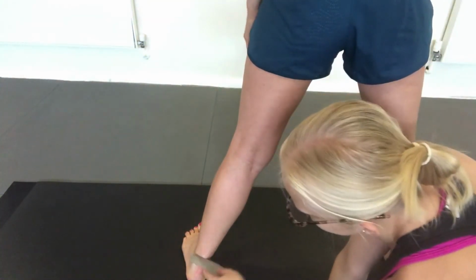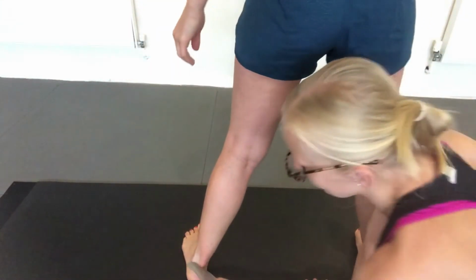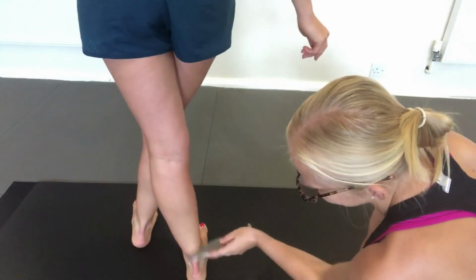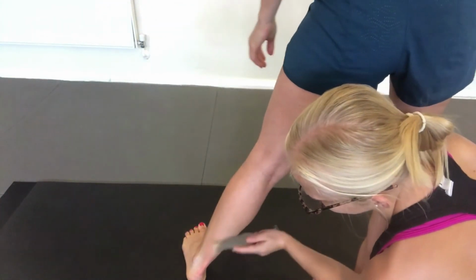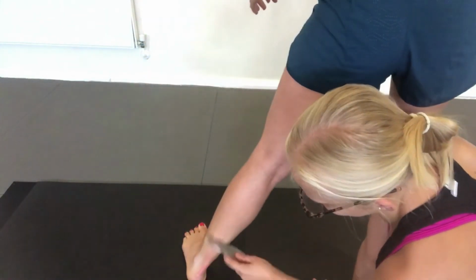And then we can add a little bit more movement, so loading the movement, and this is in the frontal plane. So you can do this in all planes of motion, but we're going to focus on the frontal plane here. So taking the leg across, so loading that tissue as you come into that side lunge position.